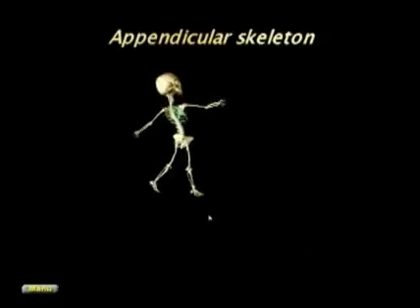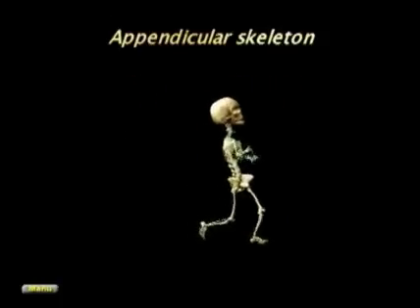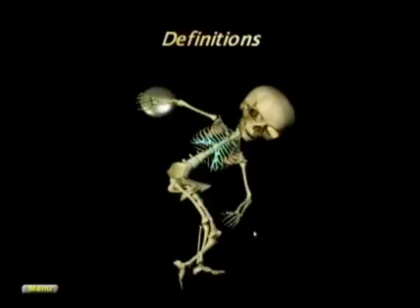Let's move now into the appendicular skeleton, and we're going to look at a great number of terminology and definitions. And no one likes to learn about definitions and terminology, but it is important because that baby that you're scanning, at some point, if it has a problem, will go in the hands of someone else, and that someone else will be a dysmorphologist, a geneticist, and telling them the baby is a funny looking kid is probably insufficient. You may want to speak the same language as they speak. So let's go over some definitions.